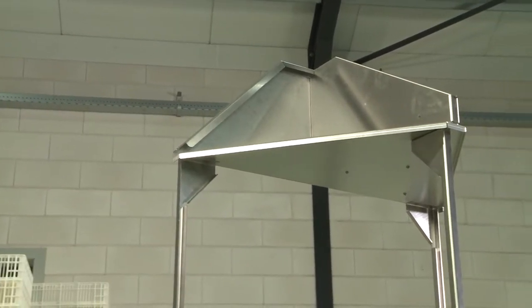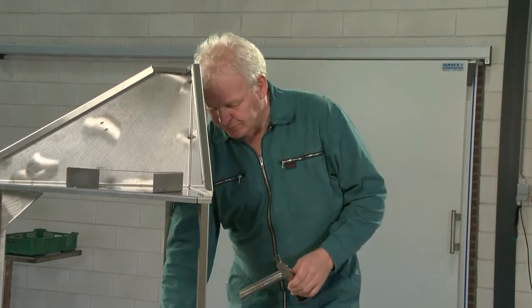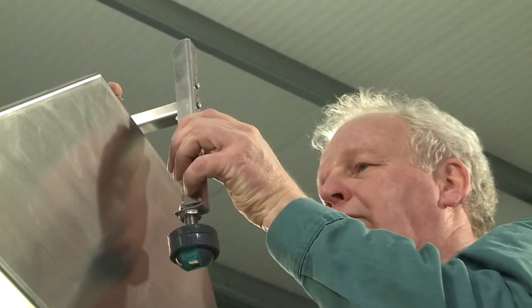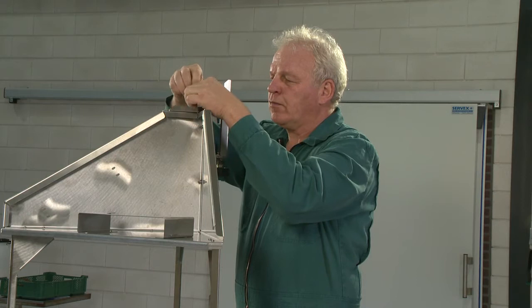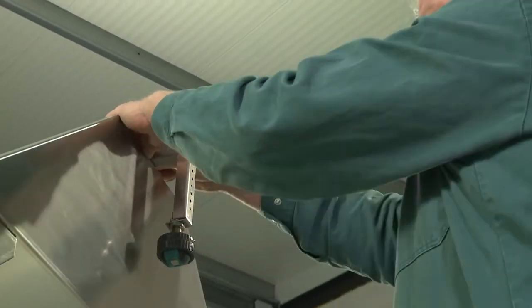Place the pre-assembled spray nozzle at the foreseen position in front of the cover and insert the two fixing screws in the pre-drilled holes. The nozzle has to be at a certain distance to the base of the crate to ensure a unique spray pattern all over the chicks. This distance is related to the crate depth. This can be checked during a test run.